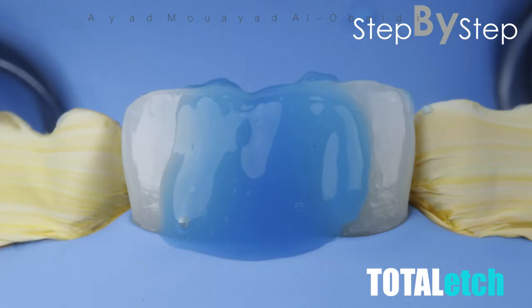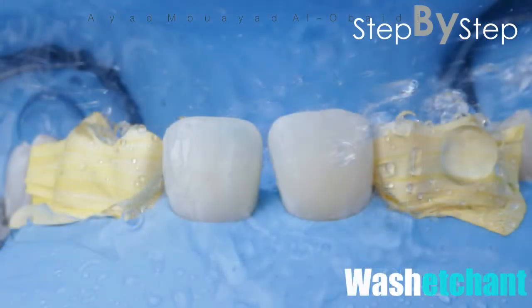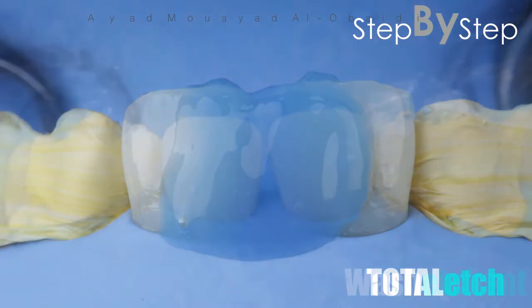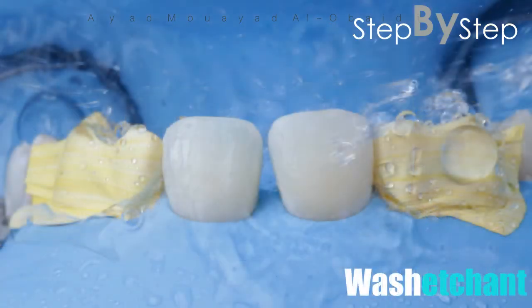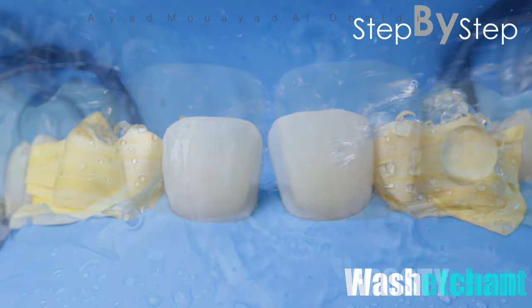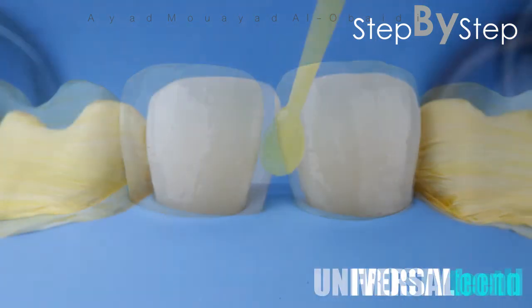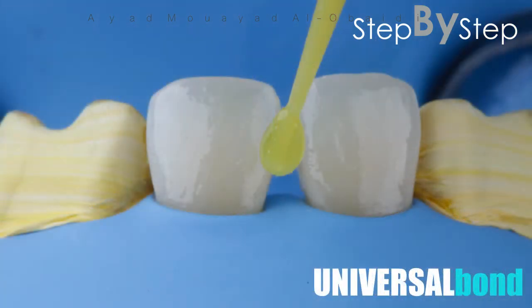We use phosphoric acid for 20 seconds, wash for 20 seconds or more, then apply the bonding agent.